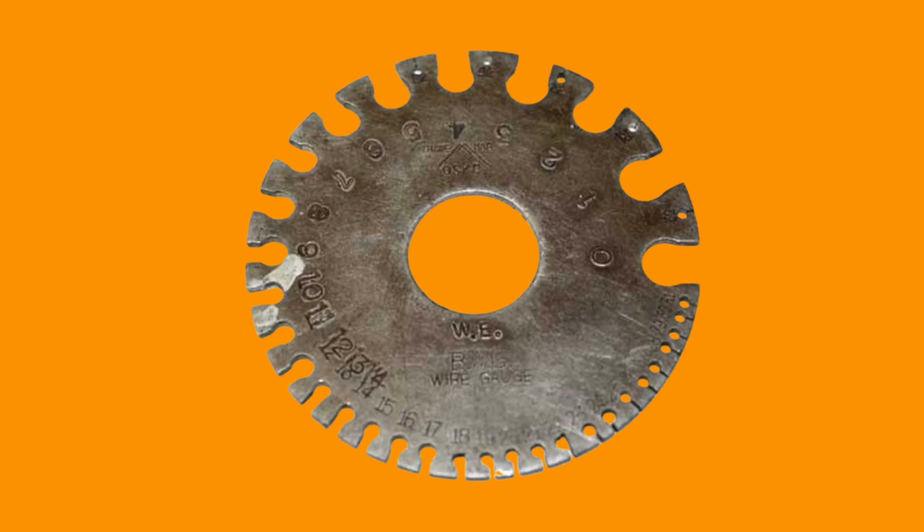The gauge, or the Birmingham gauge or Stubs iron wire gauge, was developed in the early 19th century for use in wires. The lower the number, the greater the thickness of the wire. As the wire is stretched, it becomes thinner and the gauge increases. It has subsequently been applied to medical devices including needles, catheters and cannulas. This device allows detection of the size of the gauge of the wire, and therefore the cannula size, for example.